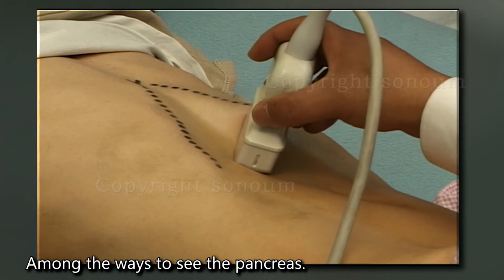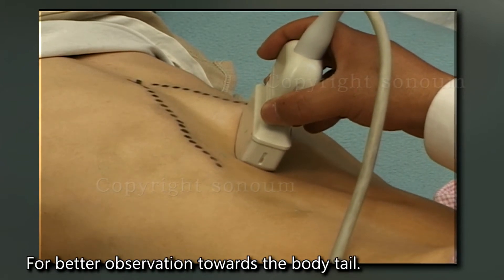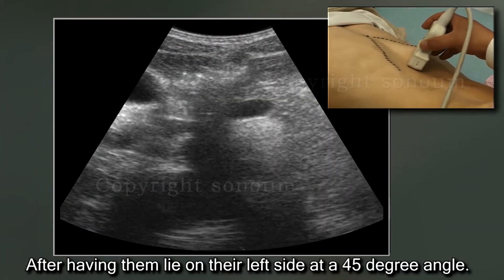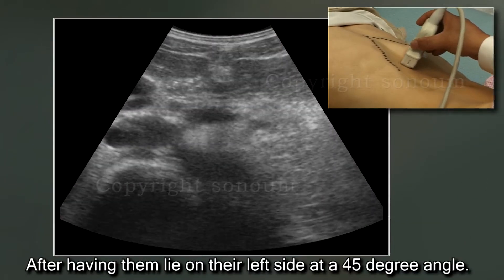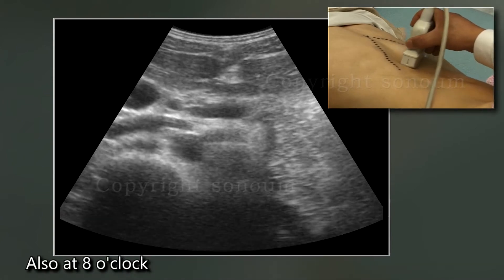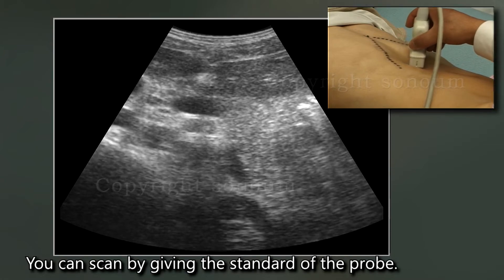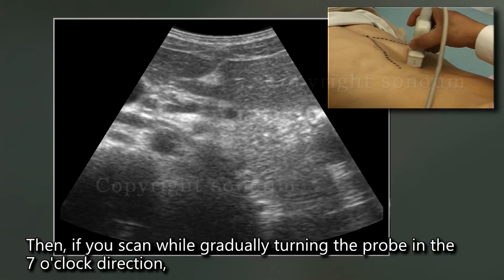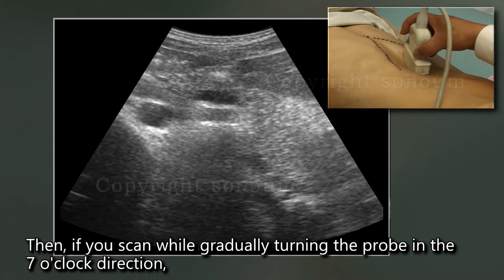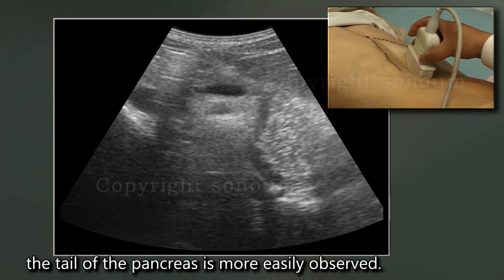Among the ways to see the pancreas, for better observation towards the body and tail, have the patient lie on their left side at a 45-degree angle. At eight o'clock you can scan by setting the probe standard, then if you scan while gradually turning the probe in the seven o'clock direction, the tail of the pancreas is more easily observed.